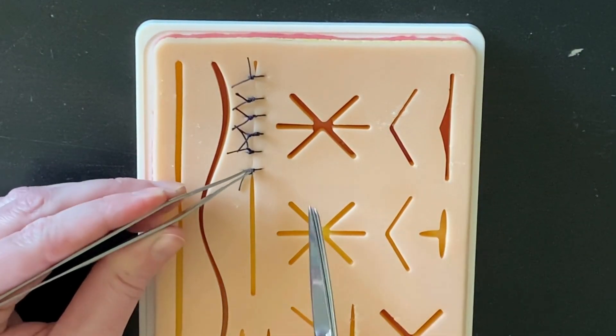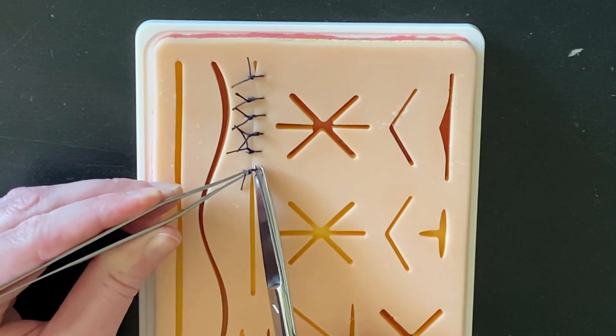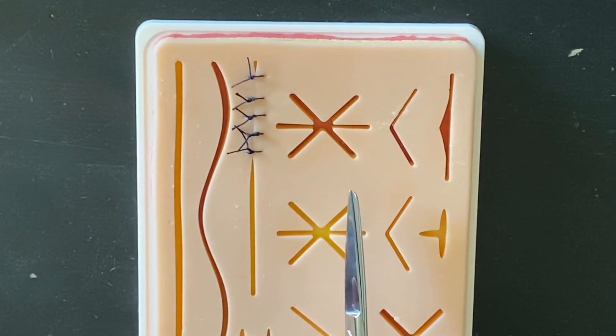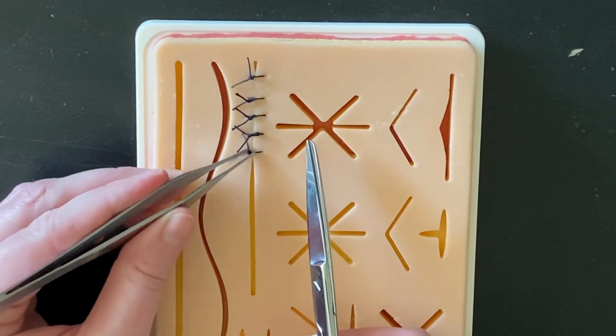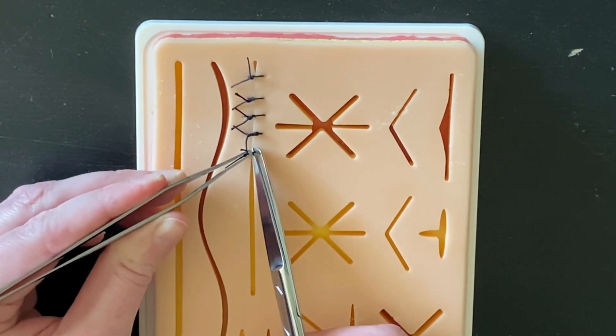This is a very basic skill, but certainly most patients are going to be nervous about suture removal when it really is usually a fairly efficient and painless process.